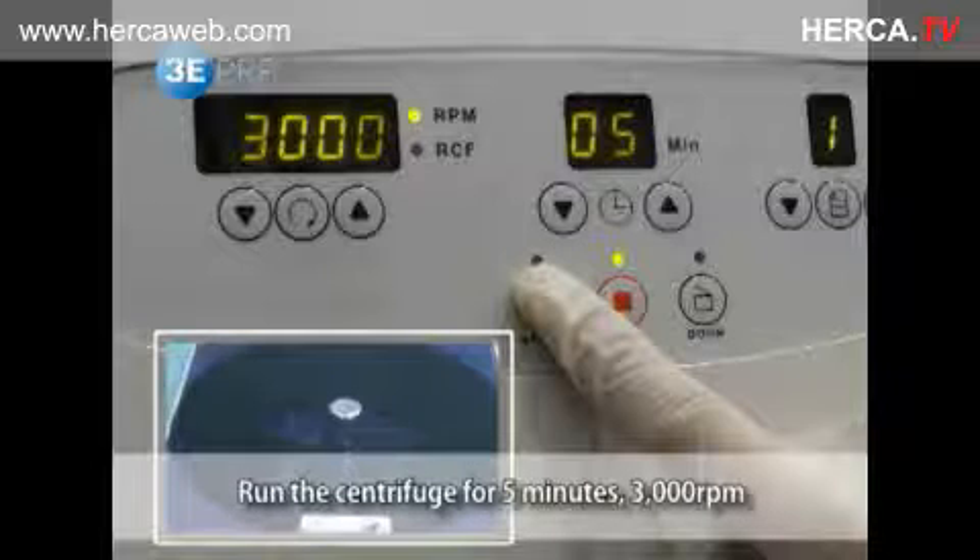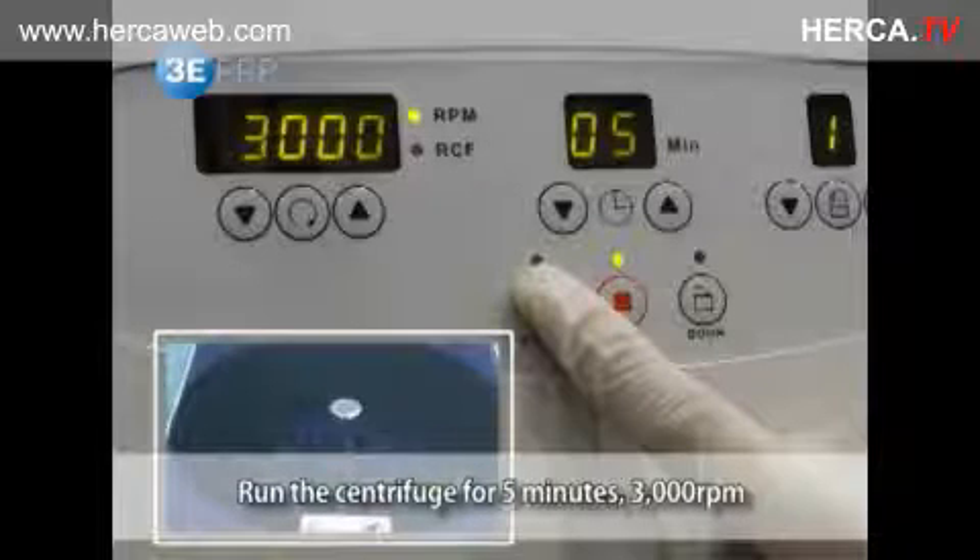Run the centrifuge for 5 minutes at the predefined setup of 3000 RPM.